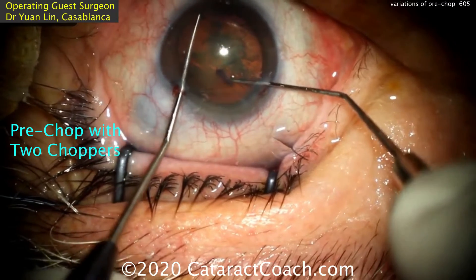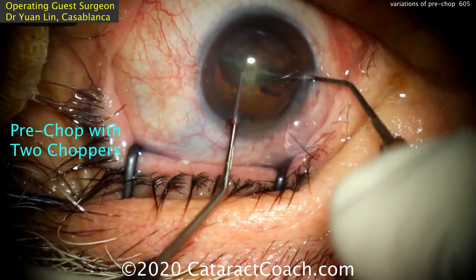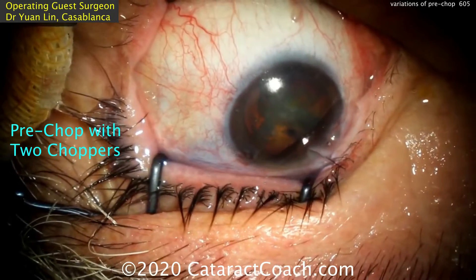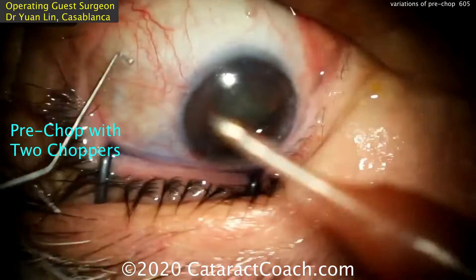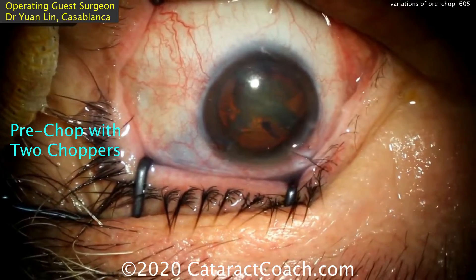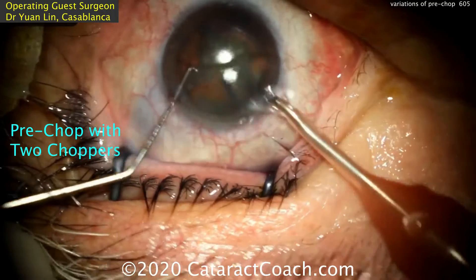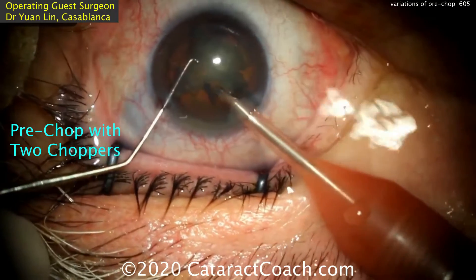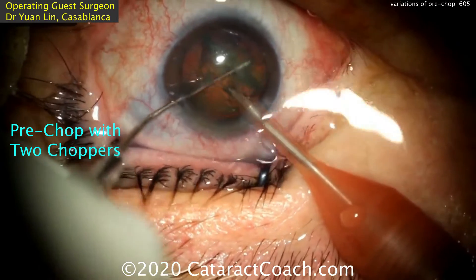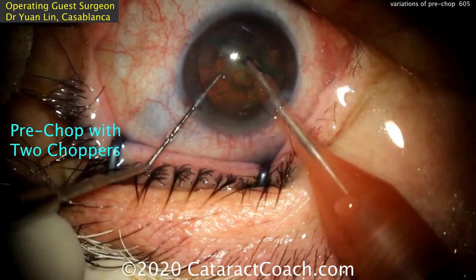Now here's pre-chop with just two choppers. Dr. Lin is placing two choppers inside the eye, digging into the nucleus and pulling apart, creating two halves — no additional instrumentation required. The phacoprobe is now being placed inside the eye. You also notice a different draping technique here, with plenty of betadine on the lid margin, though our preference is to isolate the eyelid margin and lashes. There are the two nuclear halves.